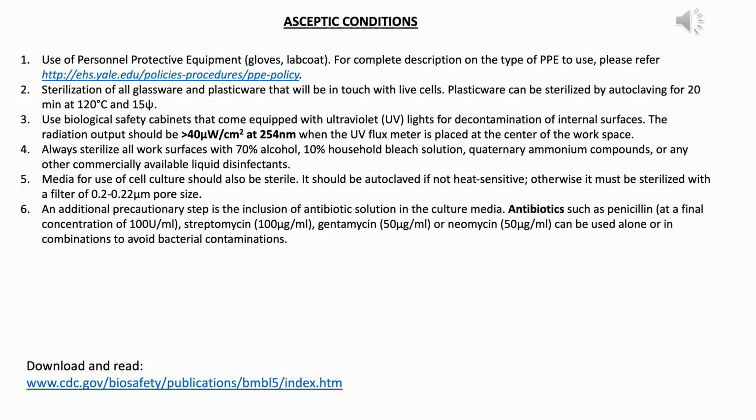The third is daily microscopic examination of your cells. You cannot plate the cells today and, because the passage is after 48 hours or after 72 hours, simply forget about them. That should never be the case. Every day one has to look for any abnormal morphology in your cells: if the cells have shrunk or become clumped, or any extra growths, debris or fragmentation that you are seeing.